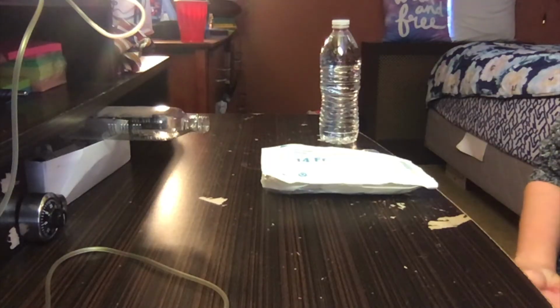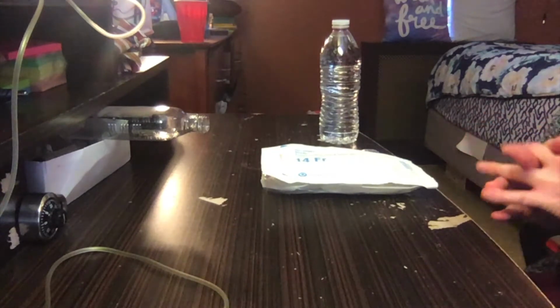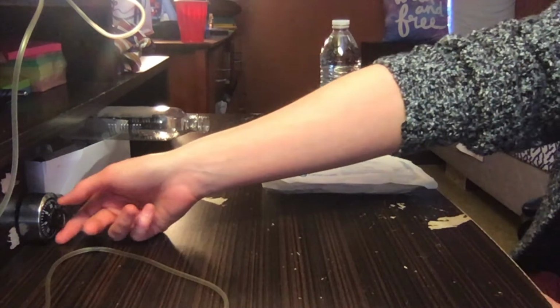Now that you're ready to do your patient's nasopharyngeal suctioning, you want to bring the bed up to a comfortable working height and bring your bedside table to waist level. I practiced hand hygiene and also made sure that my table was clean. You want to place a pad across the patient's chest for protection and turn your suction on to no more than 150 millimeters of mercury for adults. So I'm going to do that.